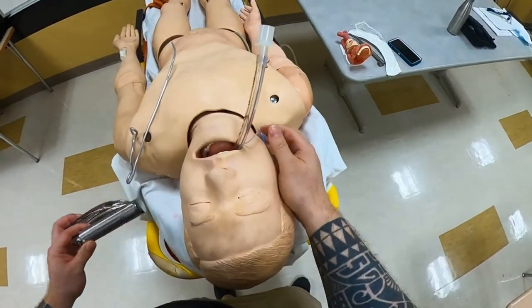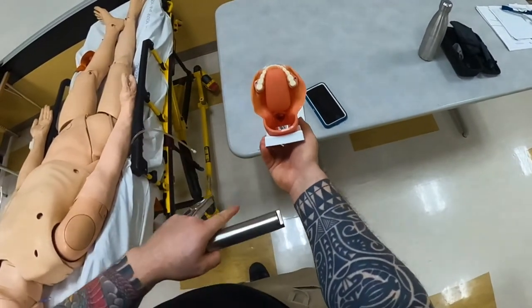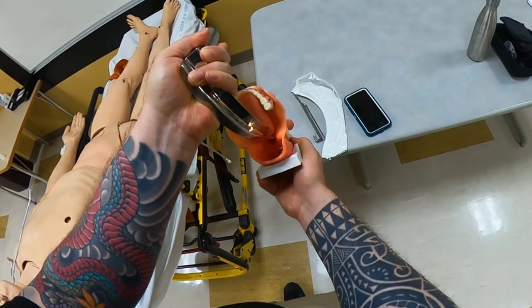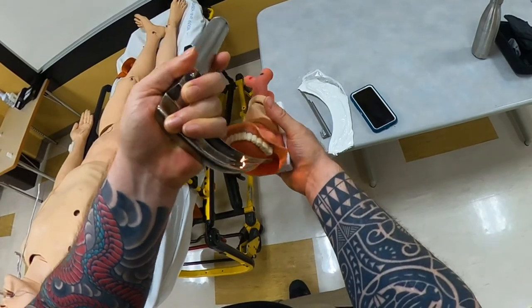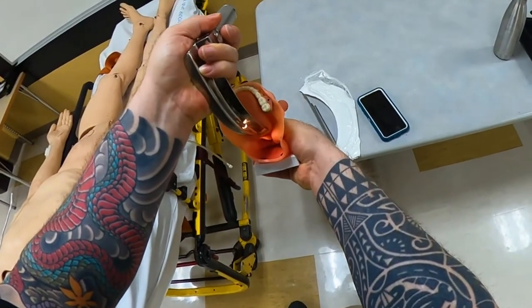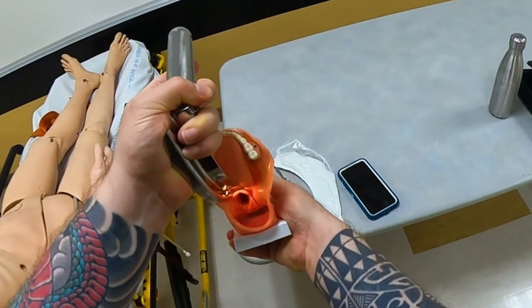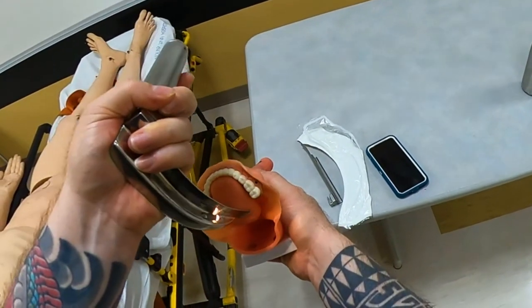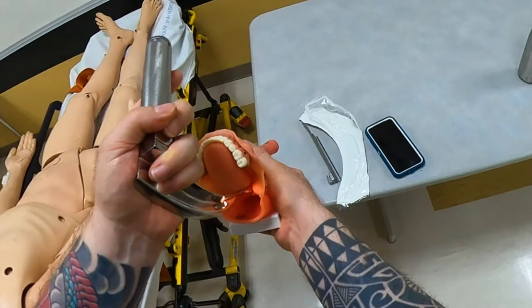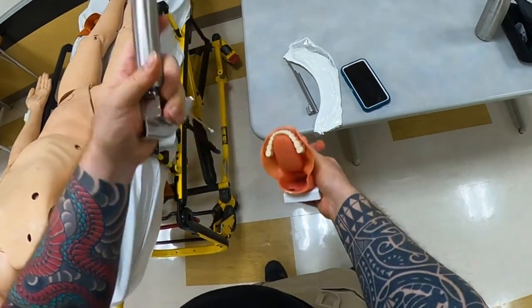Now let me move to this mannequin cutout and show you all the steps on the mannequin. Thumbs up, lower on the handle, chicken wing. On this mannequin, this is your tracheal inlet and this is your esophagus. Come in from the right, sweep towards the left, and slowly inch until you see the sliver of the epiglottis. Press on the thyroid cartilage to drop the epiglottis down. Seat the tip of the blade into the vallecula at the hyoepiglottic ligament space, then lift up — and you'll see an excellent view of the vocal cords. Lift up and forward to see the glottic inlet so you can introduce your tube. This is how you use the McIntosh blade.